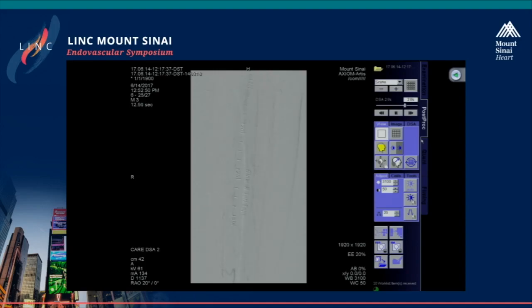So what we're going to do, and this is the shot to show you, there is an option to go antegrade, posterior tibial. Obviously I wasn't concentrating on it initially. And like Marianne said, there is a channel that I think we will be able to get through. But for the sake of time, we will stop here now. We'll see her back in clinic. We follow them weekly, and with our wound clinic as well here at Sinai. Based on how she's looking, we'll make that decision. But clearly there is an antegrade option here.